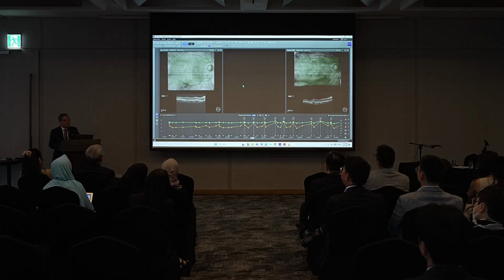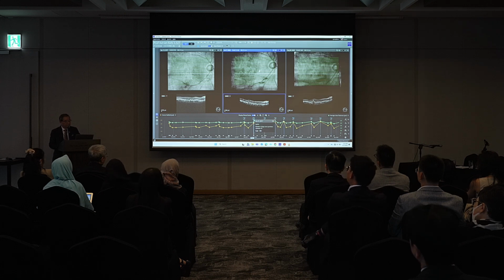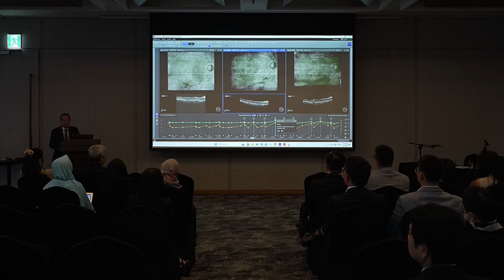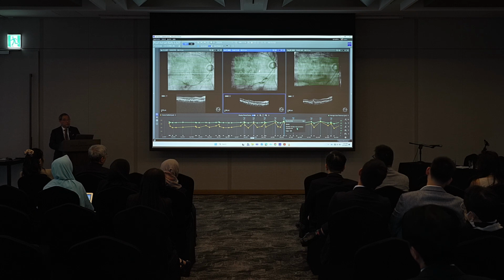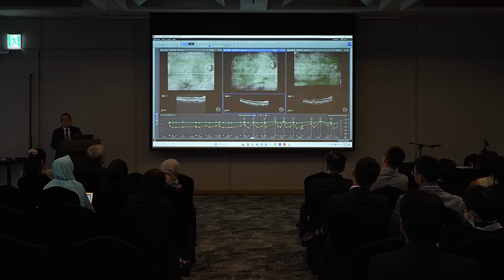Now the macula is dry. What I've tried to do here is to chart all the visits in which the patient was treated. This is incomplete, of course. But you can see then the intervals I've indicated here, 97 days between each of these treatments. Right? So every time the vision got worse, and with the macular fluid returning, the patient got PRN treatment in this case. But later on, you can find that the patient actually became more and more a frequent flyer. As fluid becomes recurrent more quickly, the patient now has to go towards a treat and extend protocol.